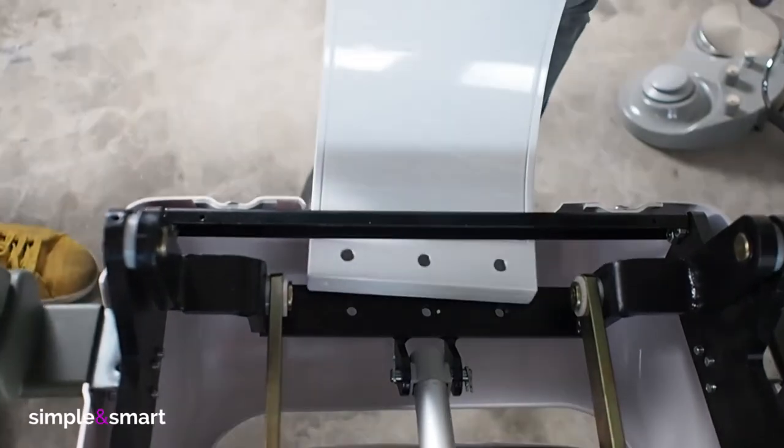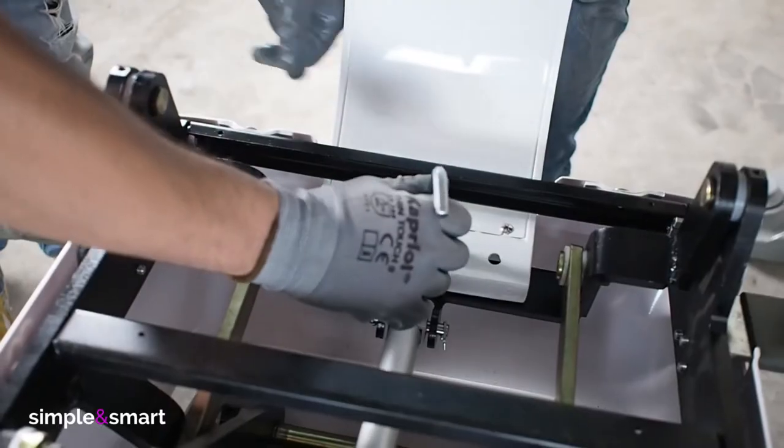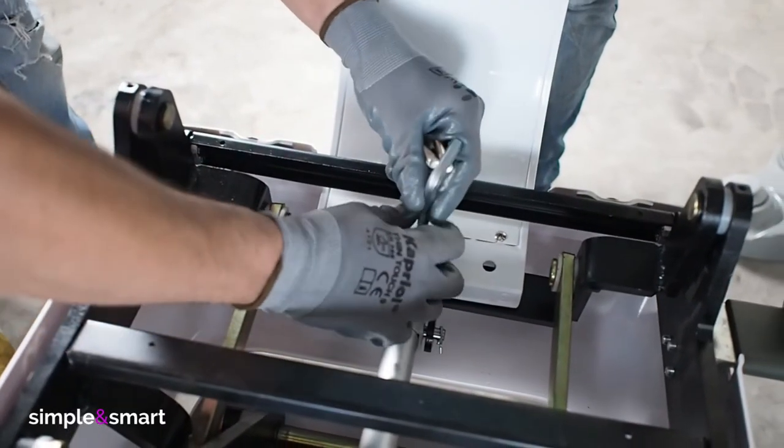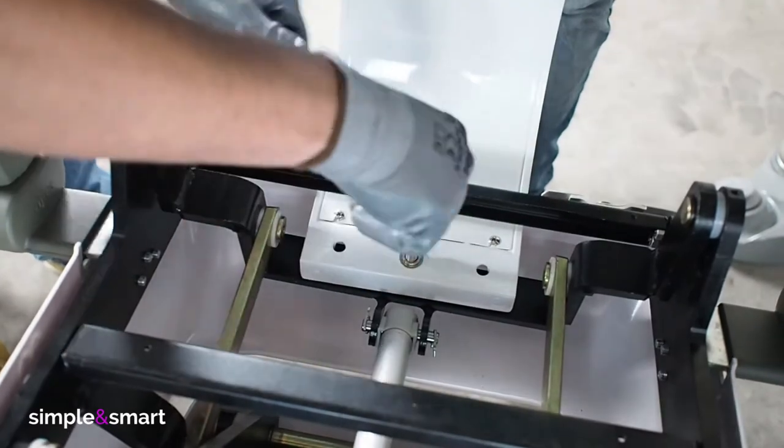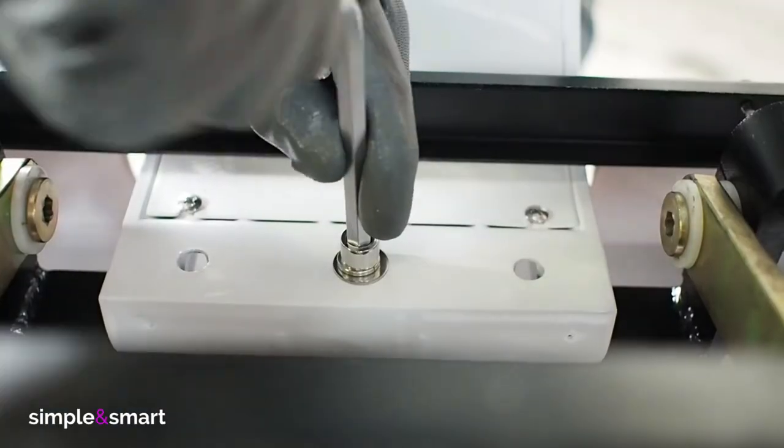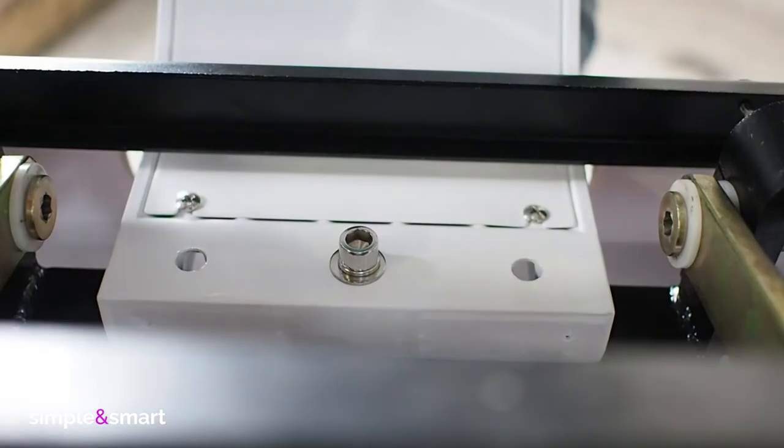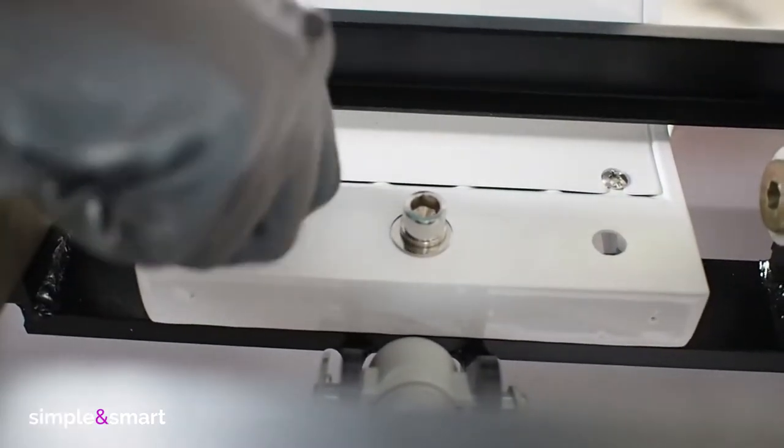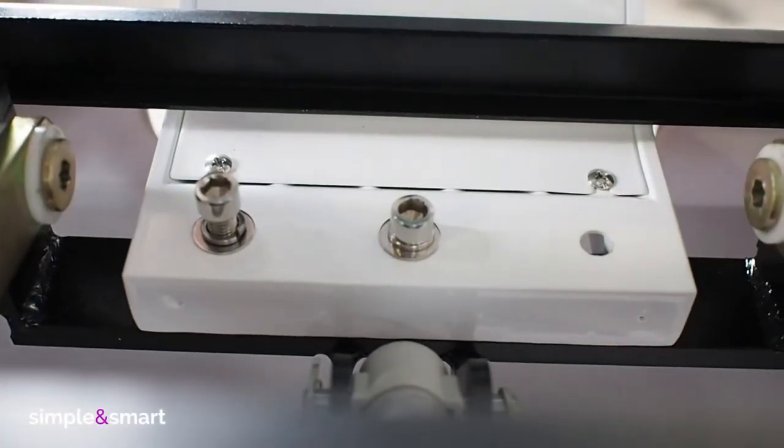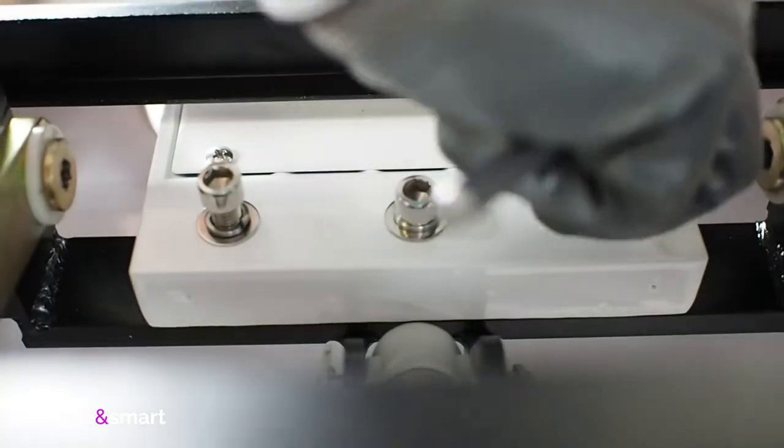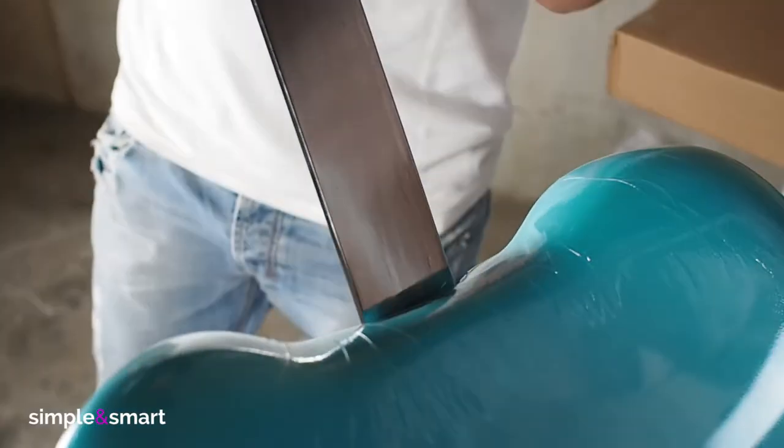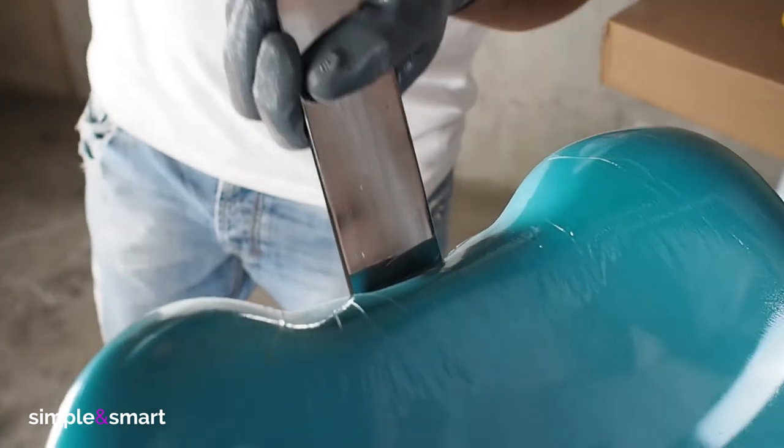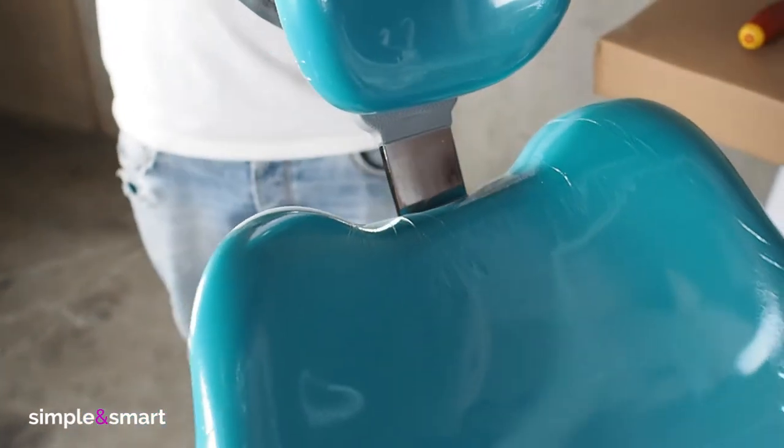Insert the backrest in position and lock with the screws. Push the headrest in the hole you find on the backrest. A mechanical friction will keep it in place.